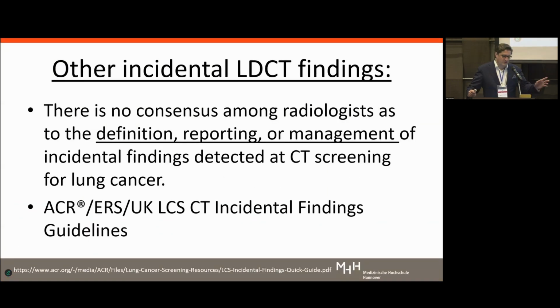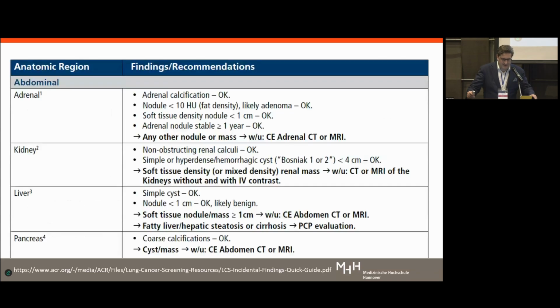So on the rest, I have a statement, and I think it's an issue to discuss. I think there's currently no consensus among radiologists as to the definition, reporting, or management of incidental findings detected at CT screening for lung cancer. There are, however, guidelines from the ACR, from the ERS, recently in the UK. I know they're doing guidelines on CT incidental findings.